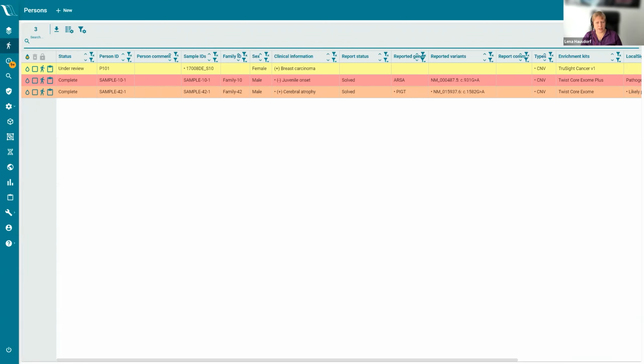But not on the criteria itself, because we actually stick to the ACMG description here. And the comments are not only user specific, but it is something that is shared across everybody in the laboratory, right? So it wouldn't be a problem if you also commented on the variant, because it's anyway visible to everybody.